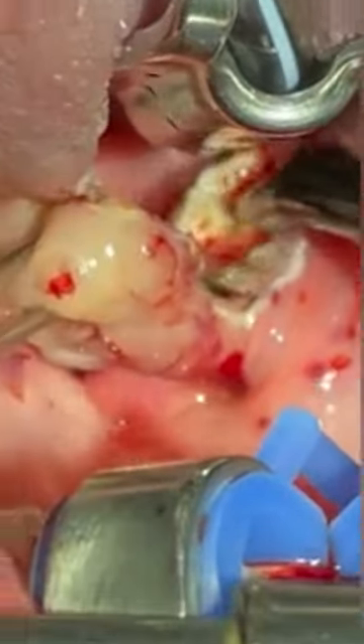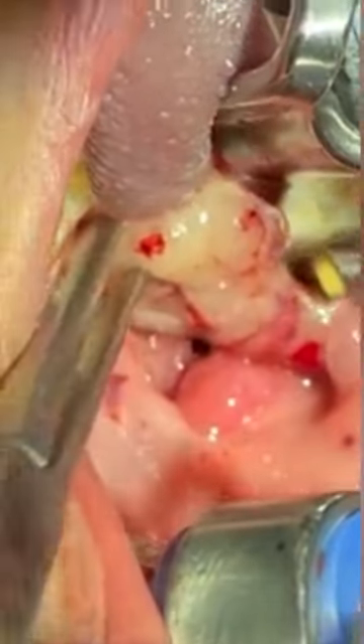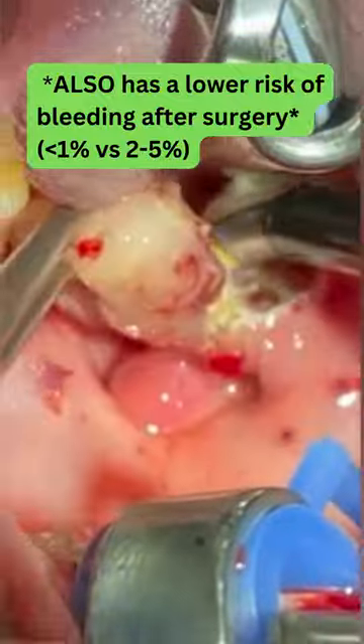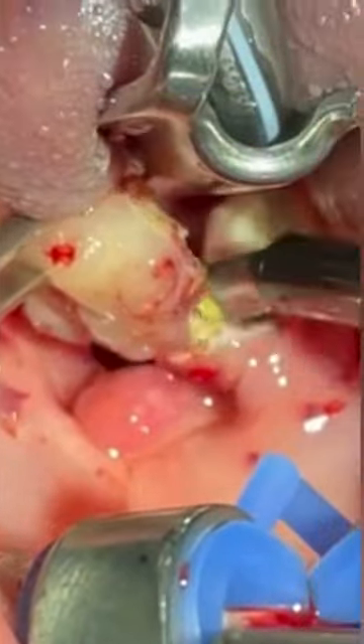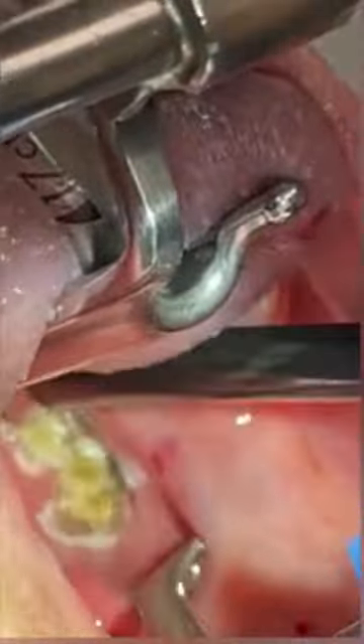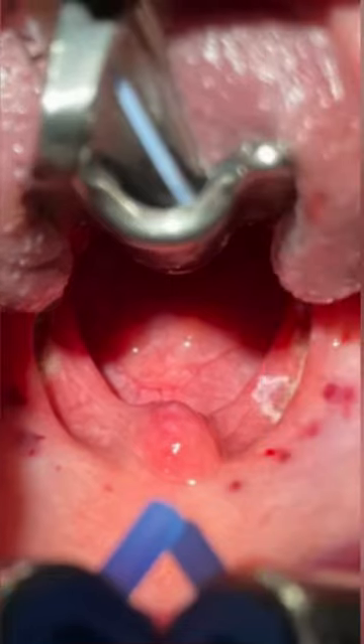Now the reason for doing this is because it is thought that this would be a more gentle recovery — but I'll do a video on this later. Once the tonsil is completely removed, a little touch-up is done to make sure as much of that tonsil tissue is gone. And this is the final product, and the airway looks much bigger.